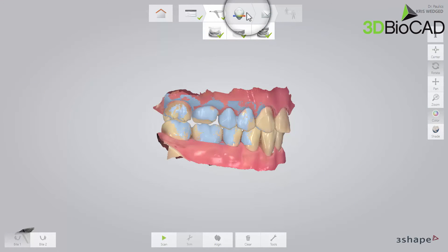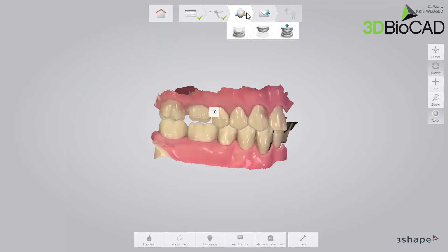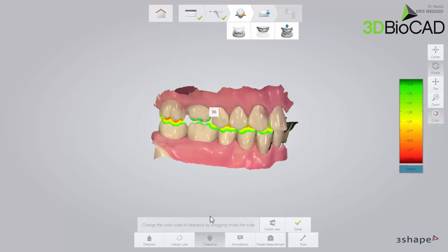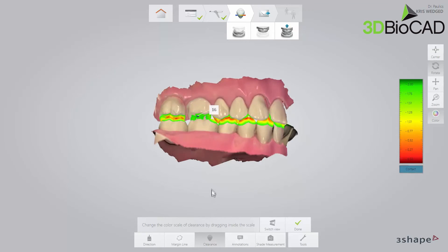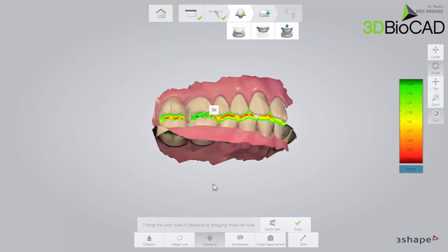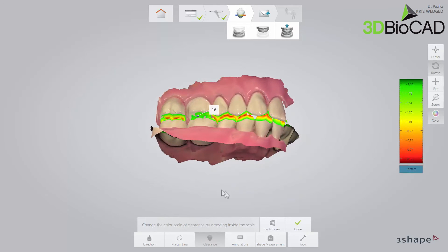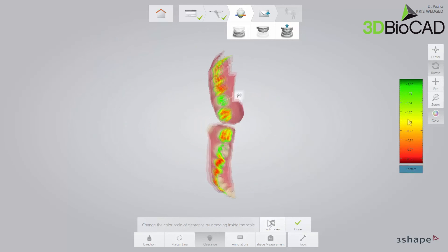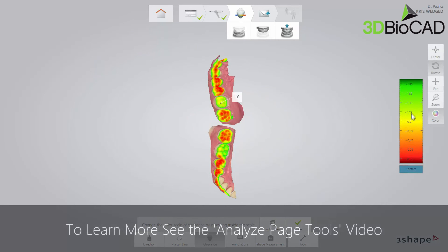Go to the validation page and confirm that there is enough space for the reconstruction between the upper and lower jaw using the clearance tool. Optionally, you can set the margin line. You can also add comments on the 3D scan using the annotation tool. To learn more, see the TRIOS Analyze Page Tools video.